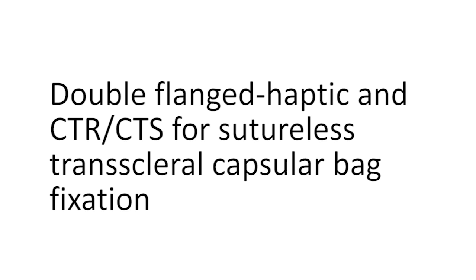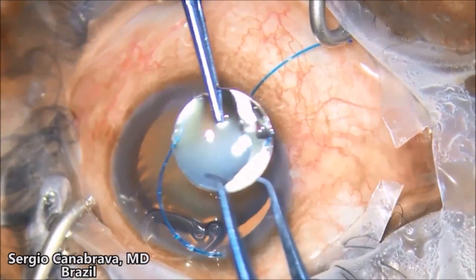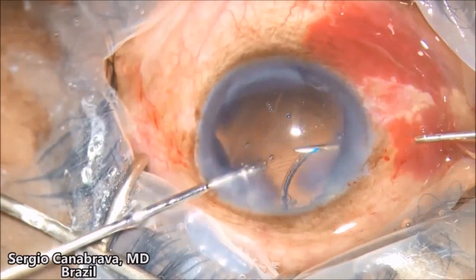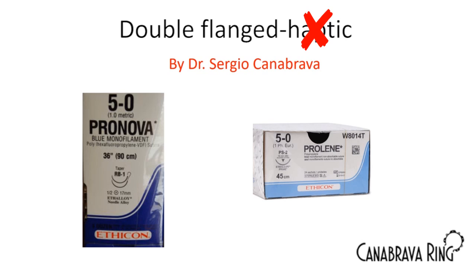For the first time, this technique was described using a CTS capsular tension segment connected to a haptic that had been removed from a three-piece IOL, as shown in this first video. In my research, I discovered that a haptic is a monofilament with 5-O size. So why not use a 5-O monofilament of polypropylene or hexafluoropropylene? We no longer need the haptic, and the best technique name is the double flanged suture-less capsular tension segment or capsular tension ring.